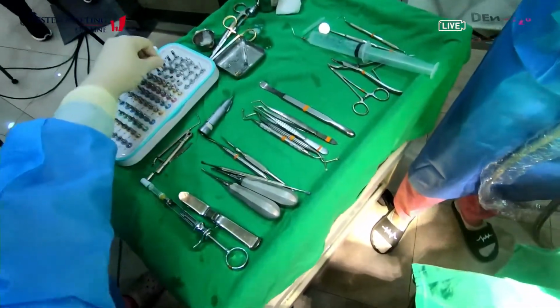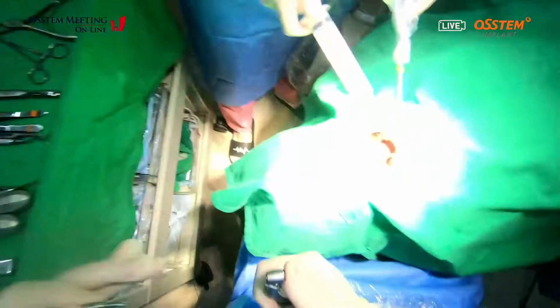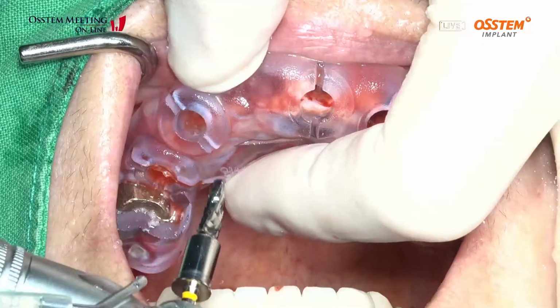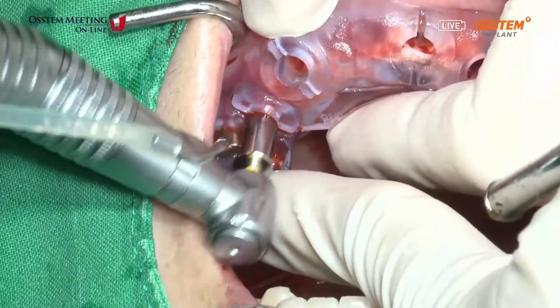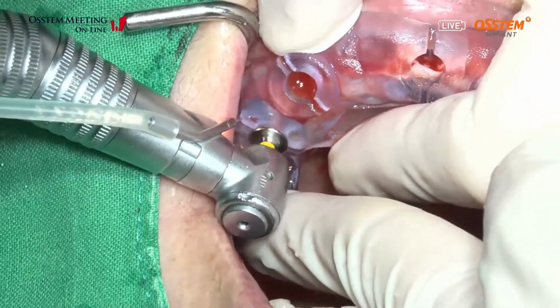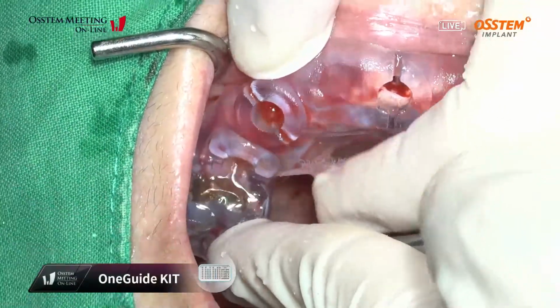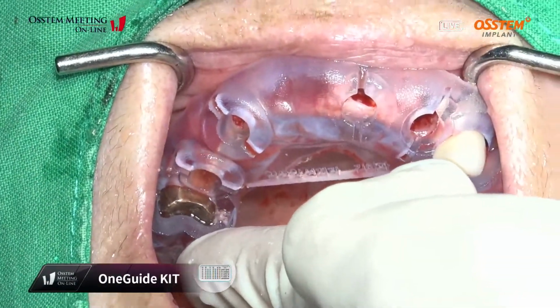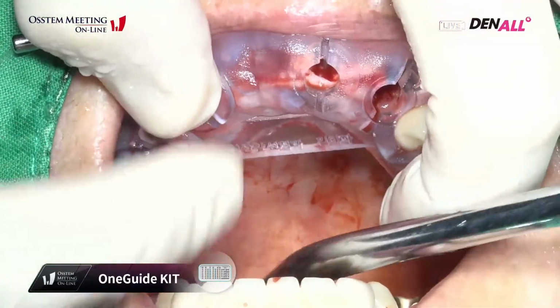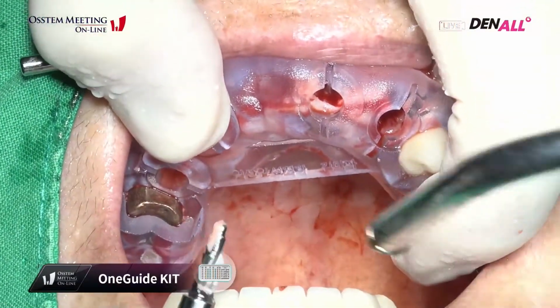But in the second premolar area, I placed 4.0 by 8.5. So this is a 3.5 by 8.5. And in the second premolar area, the bone quality is not so good. So I will do undersized drilling.